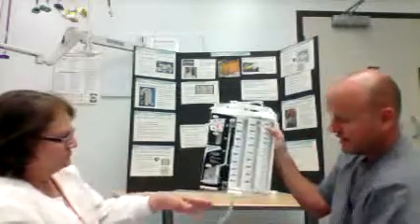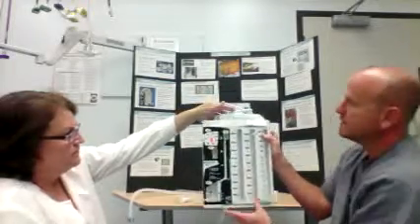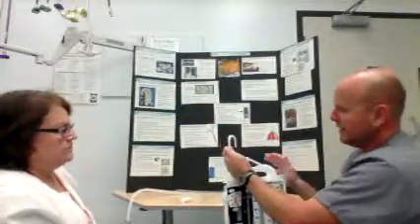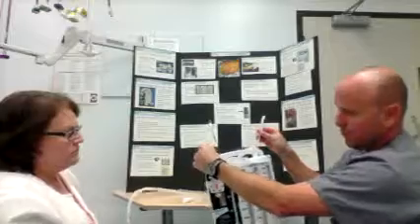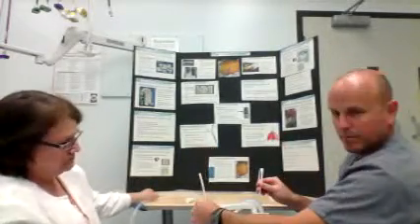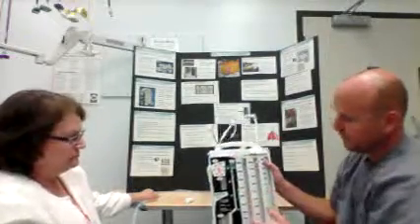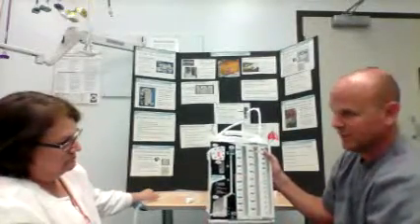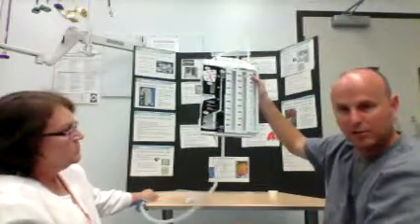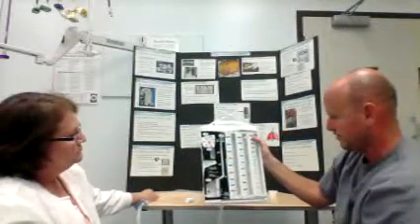It has a floor stand that you can set it on the floor right here. However, it does have the hooks. And it's preferable when you have a closed drainage system chest tube to hang it on the bed rail below the patient, because it is gravity and suction fed. If it's on water seal, it's 100% gravity fed. So of course you don't want it up higher than the patient's chest. So that's the main parts of a closed drainage system.